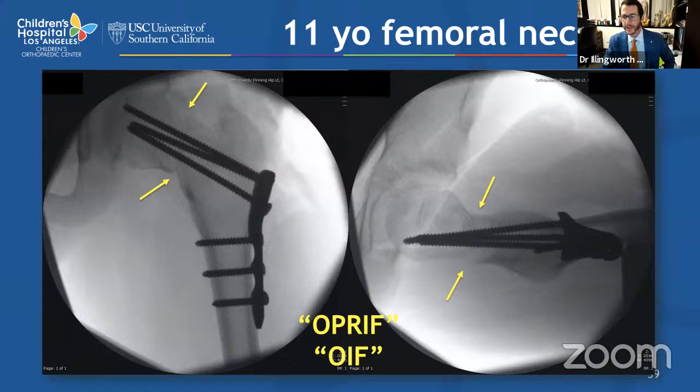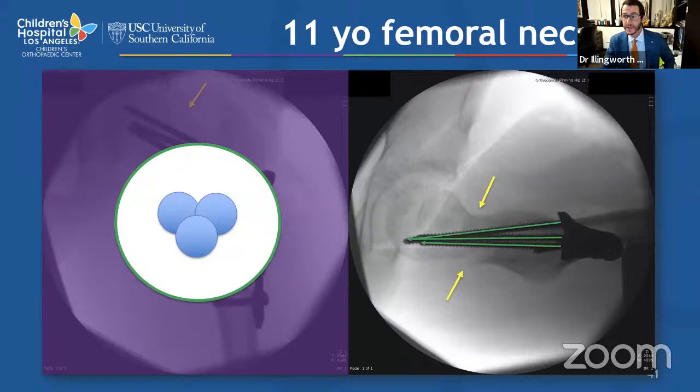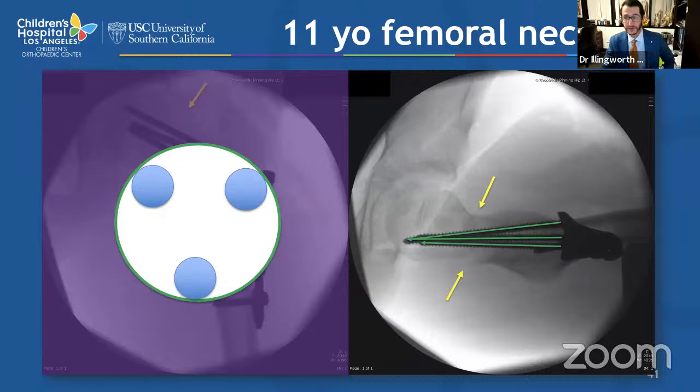So this is a proximal femoral locking plate, but certain implants angle your screws in certain directions. And you can see how these basically aim in a conical fashion, right? In my hands, I want better spread of the screws at the fracture site in order to buttress that femoral neck. Essentially, these particular screws are conical and going through the femoral neck in this particular orientation. I prefer them to be more buttressing around the edges of the femoral neck and the fracture site.